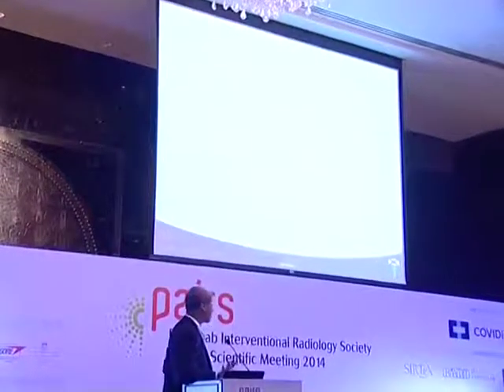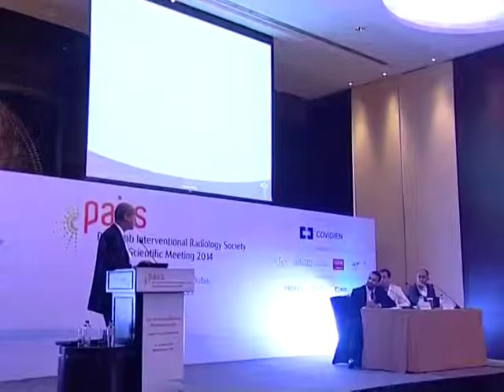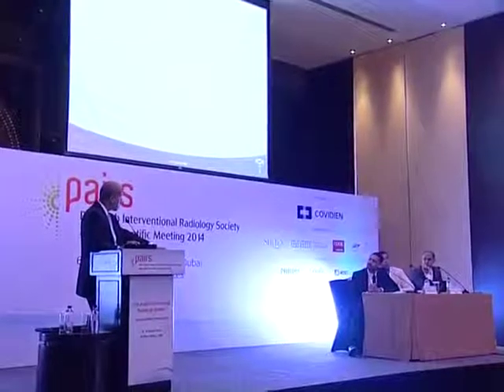So that's the distal flow, and that's the pattern of the SFA. So what would you do? I gave you your outflow information. I think I'd put a Viabahn across that. You'd put a Viabahn? I'd put a Viabahn across it. I would image the outflow vessel. I'd do a tibial angioplasty, optimize the outflow vessels. Any concerns about that? Yeah, please.